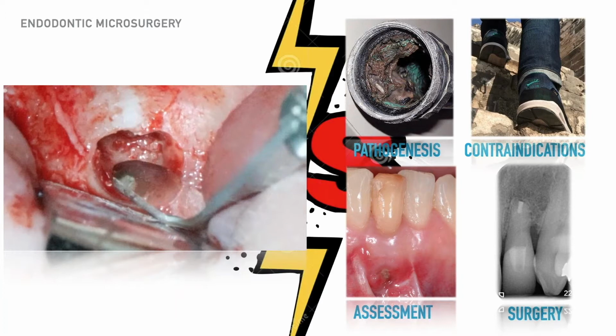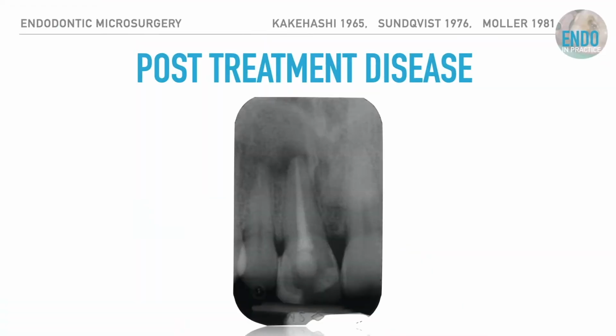Okay, so first slide. You've maybe seen this before, but this patient comes in and has vague symptoms of periradicular disease, so occasional discomfort over the apex, occasional tenderness to percussion. The root treatment was done about 8 years ago. You take the radiograph. What would your preferences be here? So here's the next poll.